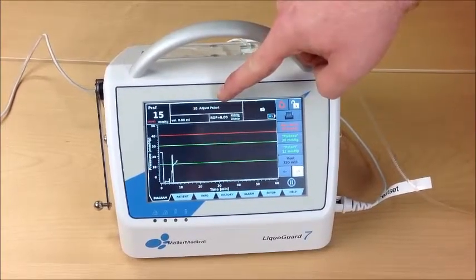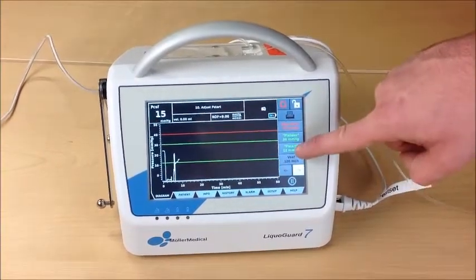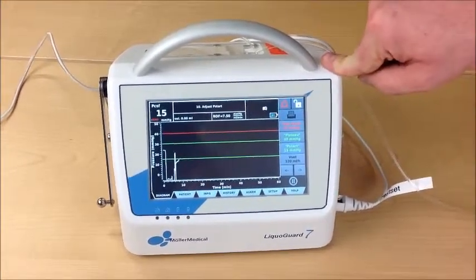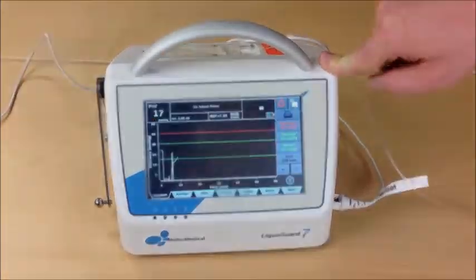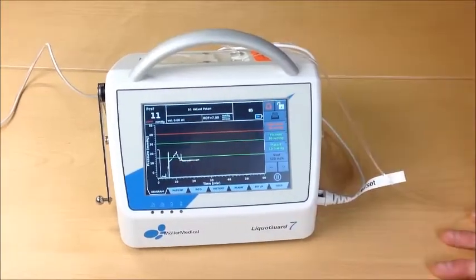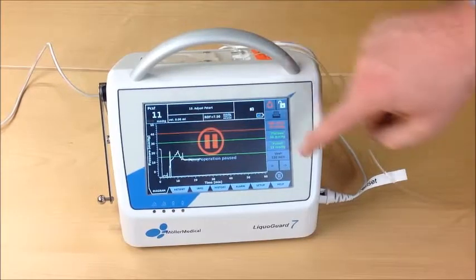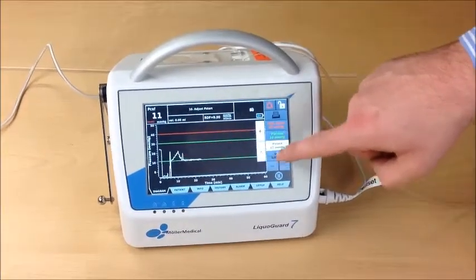Adjust PSTART — the lower green line — which represents the pressure the patient has when we are not infusing anything. Let the patient lay flat on the stretcher and monitor the pressure. After some time, once the pressure is stable and you are not manipulating the patient anymore, level the PSTART lower green line to that certain pressure value.